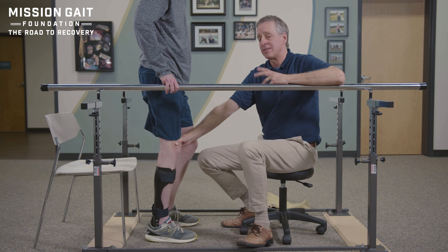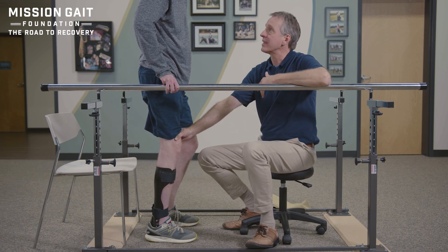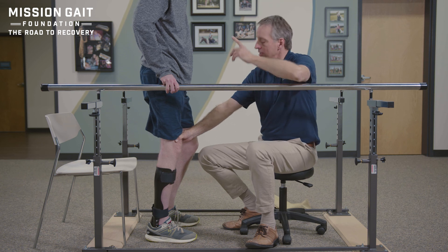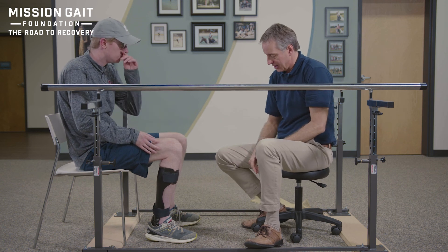Now with Ryan, I want to talk to him about doing this himself before he takes it home. In a second we're going to sit down, take it off, and have him put it all back on himself so he knows how to do that. Ryan has done this before, so I'm going to let him go through the process and show you. Go ahead and take it off.